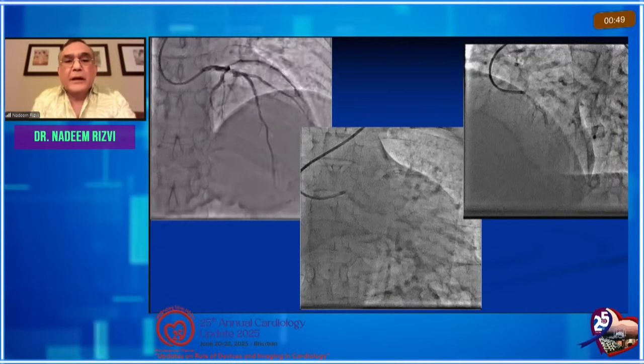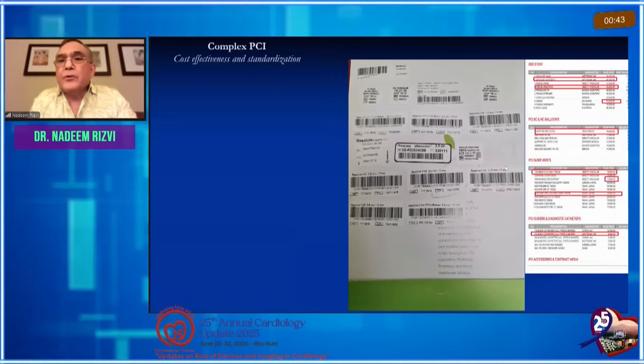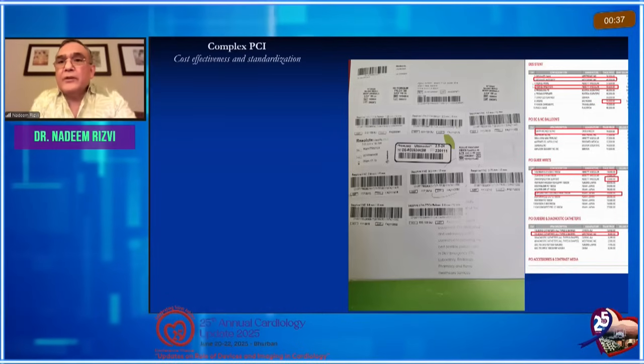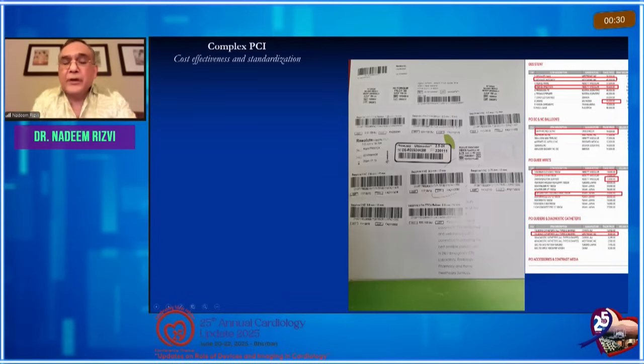and then you can see that the result is acceptable. So my aim of showing this case was, look at this inventory. The inventory shown here shows you what has been used, and if you can see it, it's around 475,000 rupees of just using inventory in Pakistan.